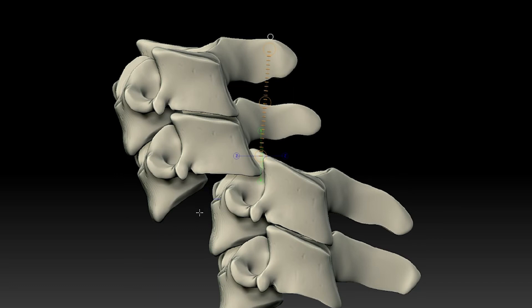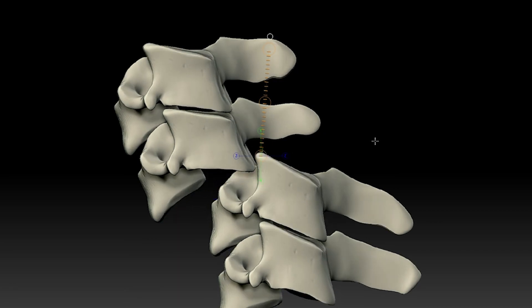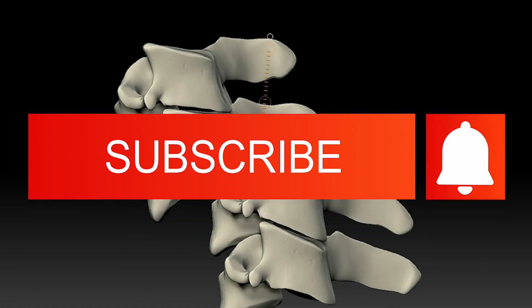Notice that with unilateral and bilateral facet dislocation injuries, we almost invariably will have some degree of spondylolisthesis — so that's the level you have to scrutinize to look for a facet dislocation injury. Facet subluxation would be the only one where you may just have what looks like a postural kyphosis, but not a definite spondy. But if you see a cervical spondy in a traumatic setting, that's the level you really want to spend a lot of time scrutinizing the posterior elements to look for some type of facet injury.